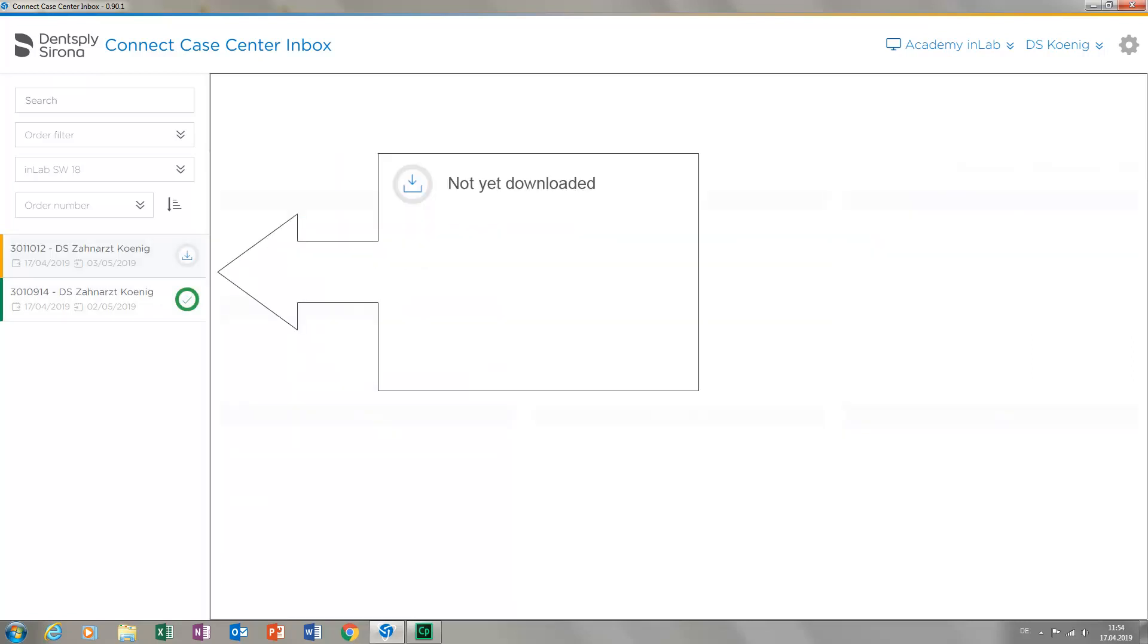The first case was sent by the dental practice Koenig and has not yet been downloaded, indicated by the arrow that points downwards. The second case, which is marked with a green circle and a green check mark, has already been downloaded and accepted.